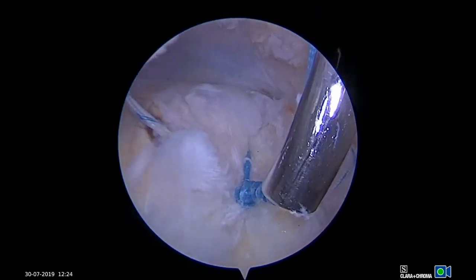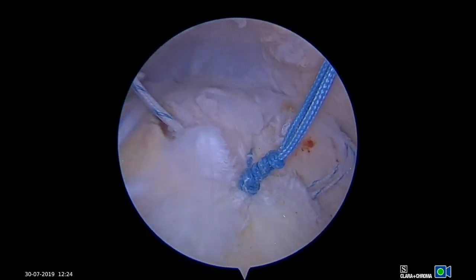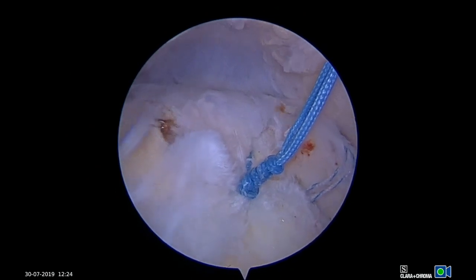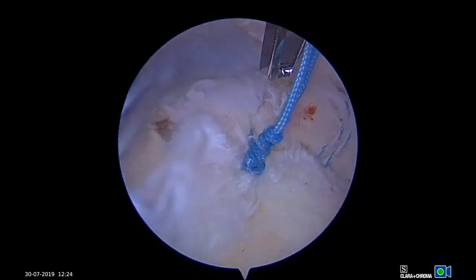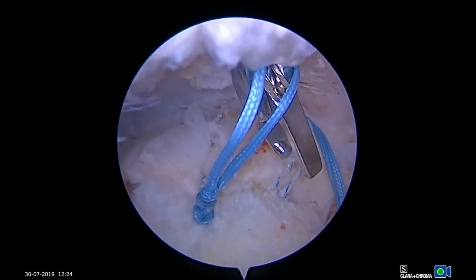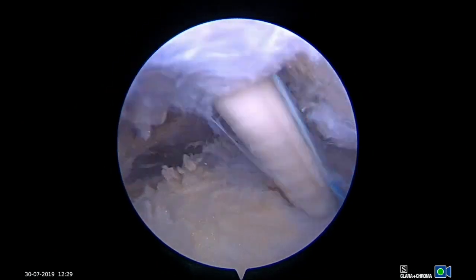The arthroscope is then placed back into the posterior portal. Shown here are the lateral pass sutures prior to knot tying. Once tied, the bursal split is nicely closed. At this point sutures can be cut; however, we prefer to add a lateral row knotless anchor to take tension off the medial row knots and to lay the knot stack flat.